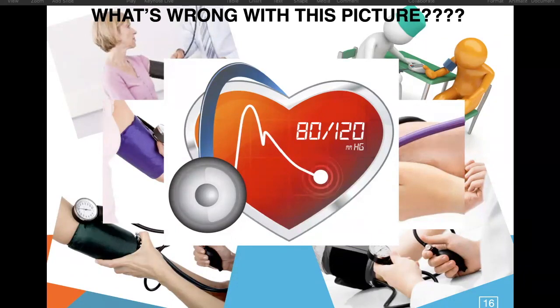And as we talked about earlier in this presentation, that systolic over diastolic, the heart at work over the heart at rest. The heart at work is going to be the larger pressure. The heart at rest will be the less pressure. So the bigger number should be over the smaller number. This should be reported as a 120/80 for an auscultated blood pressure.